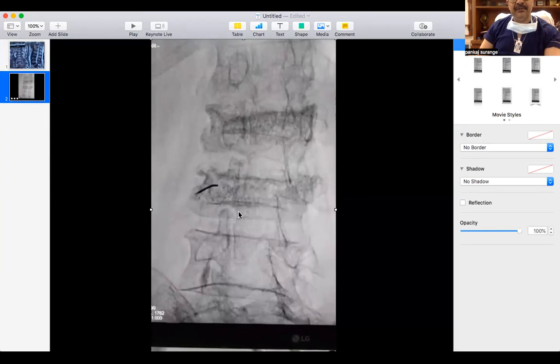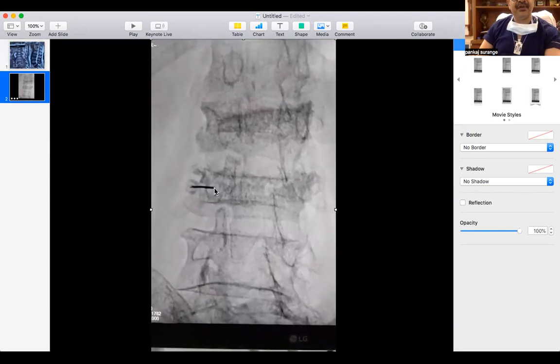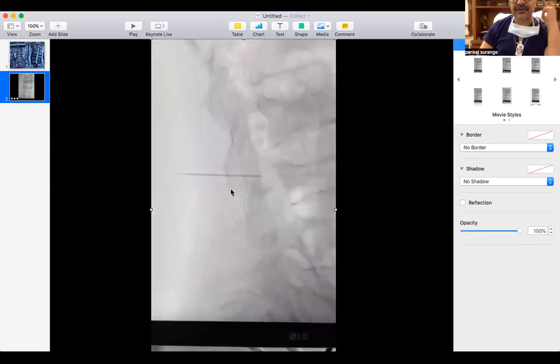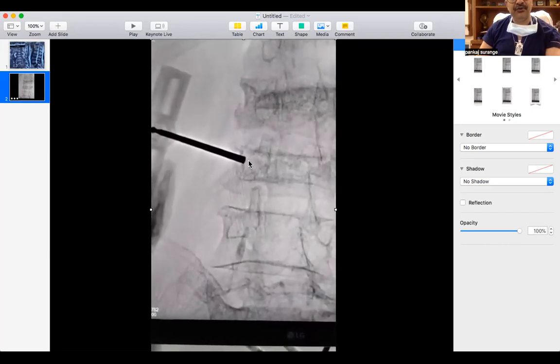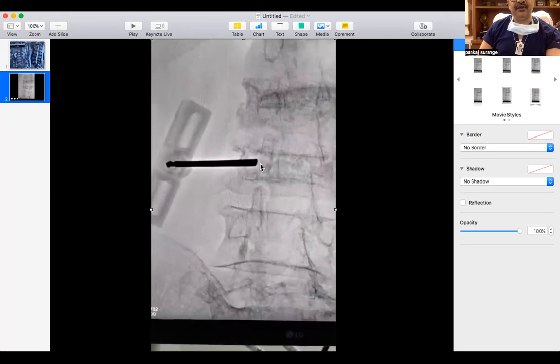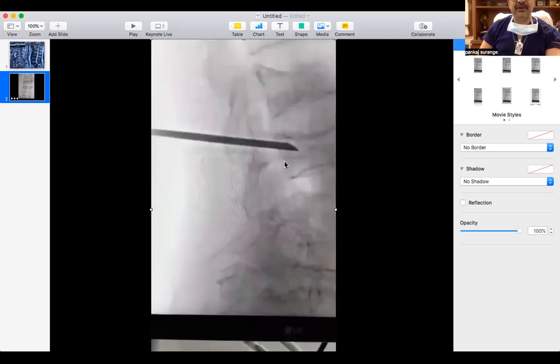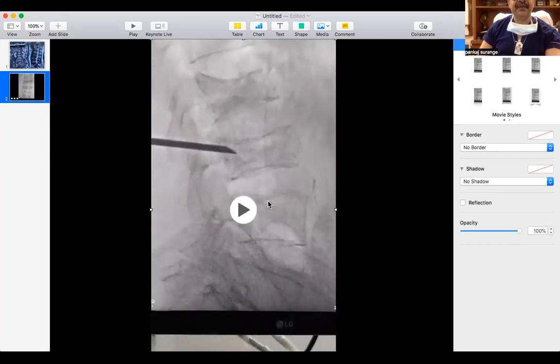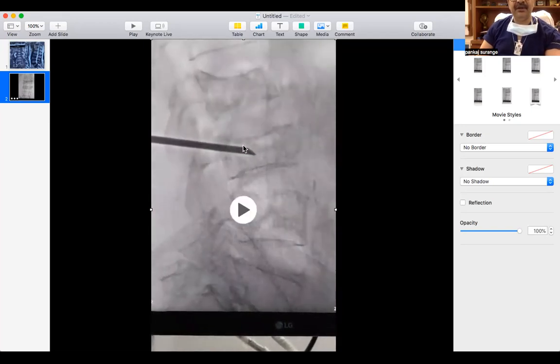So you can see this is oblique. This is how we go oblique. We go with this 22 gauge needle, up to the junction of the SAP and the transverse process. Check lateral, see, maybe now this is the trocar which goes inside, and now we have started going inside. So you have to be careful about the medial border of the pedicle, till the time you reach the posterior cortex, we all know that. And we can see from here, there's a cleft over here. So this is what I intend to fill.